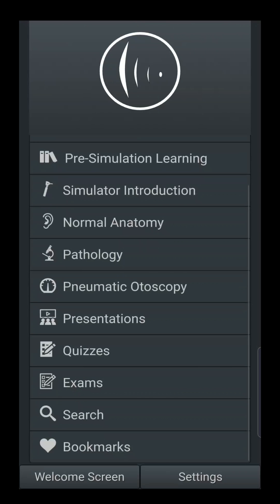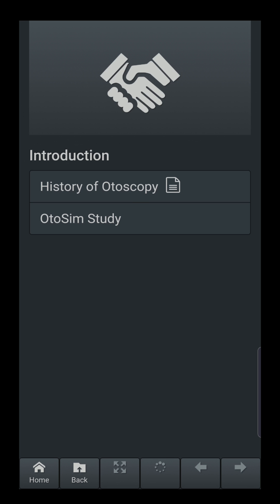The program has been designed so that if you work your way through it from beginning to end, you will become a very proficient user of the otoscope and develop the ability to correctly diagnose conditions that affect the human ear. We're going to go through these one step at a time. Starting with the Introduction section — you'll see two sections: the history of otoscopy and some Otosim studies.